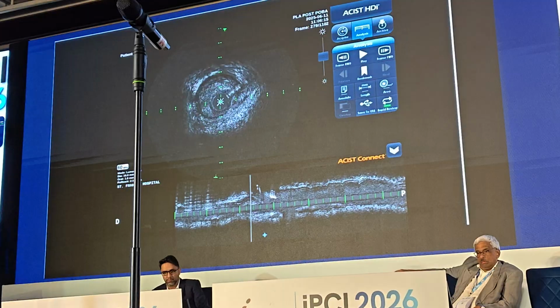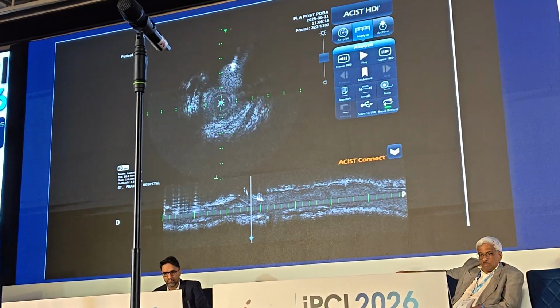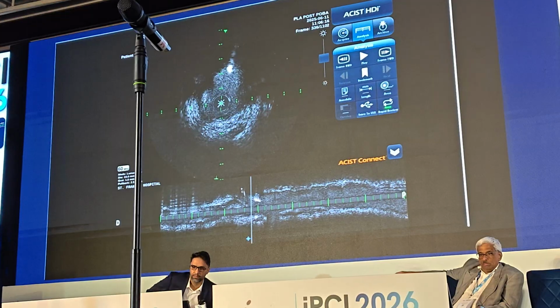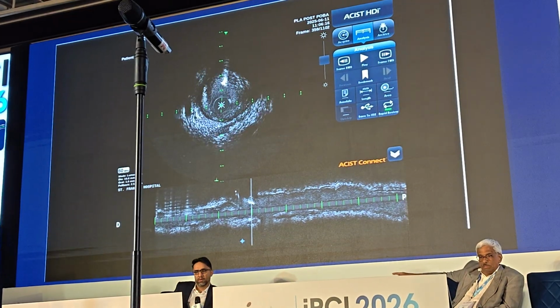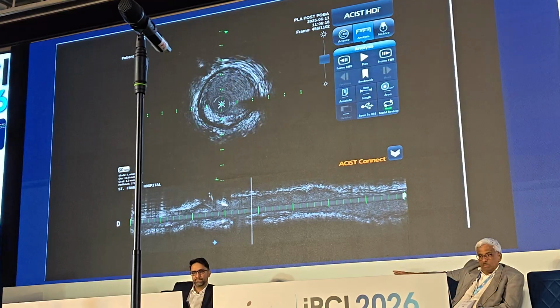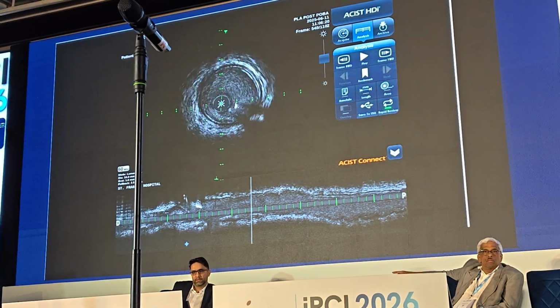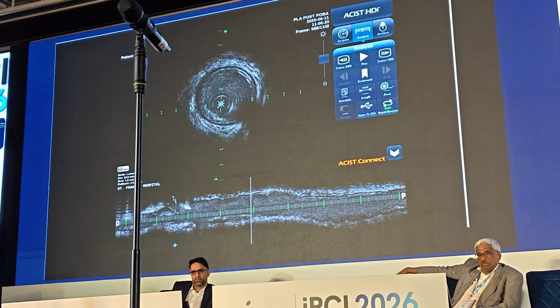Soft plaque, so extensive soft plaque here, even after pre-dilatation. You see at 12, 1 o'clock, that's our bifurcation. That's a true bifurcation with the wire coming in from the PDA. And then proximal, this is the distal RCA with a little bit of plaque that we decided to cover, so this way we're treating from healthy to healthy.